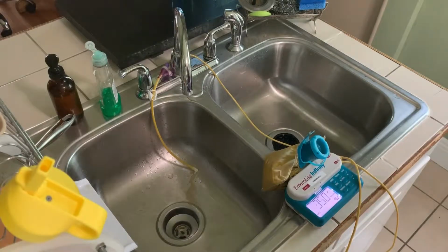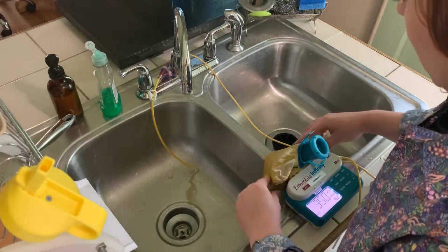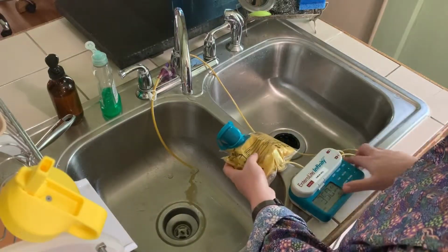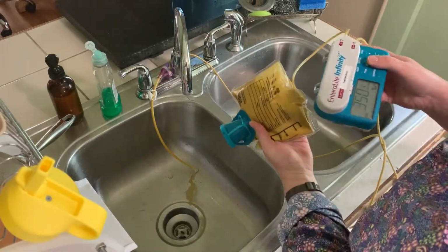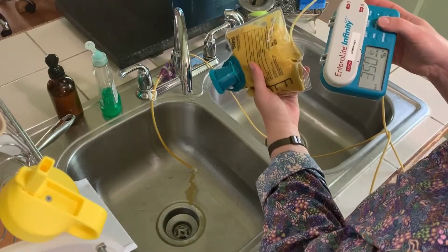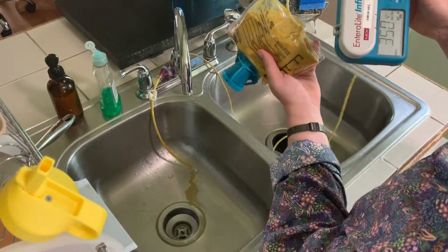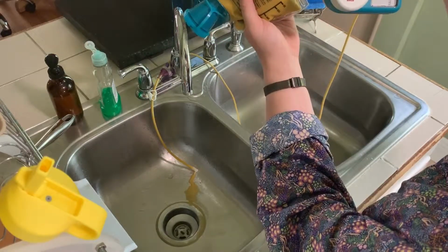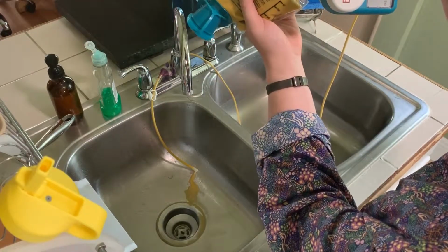What to do when you get an air bubble. Sometimes the feeding bag, the little backpack, will get tipped over or something happens, and as you can see, if it's tipped, it's just sucking the air and it doesn't register it right away. And if it's a small enough air bubble, the pump won't even register it at all.